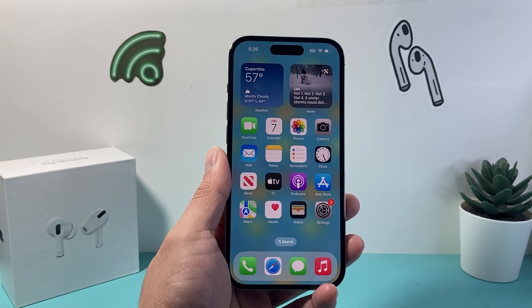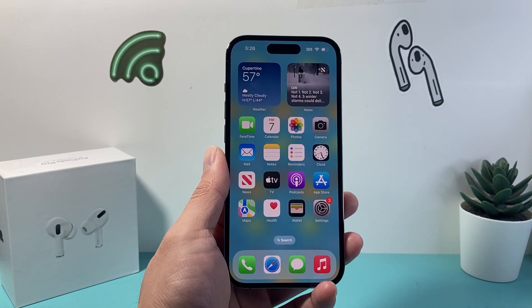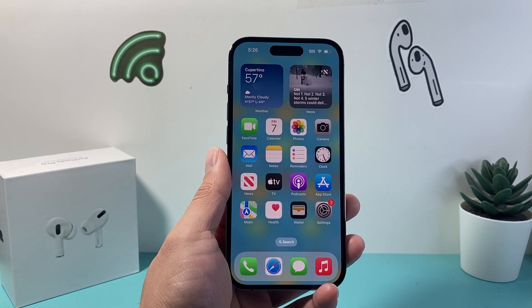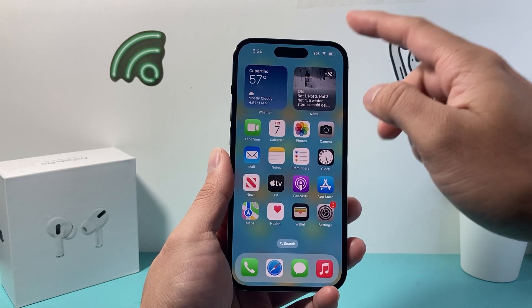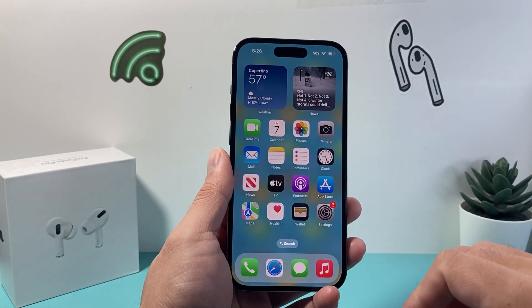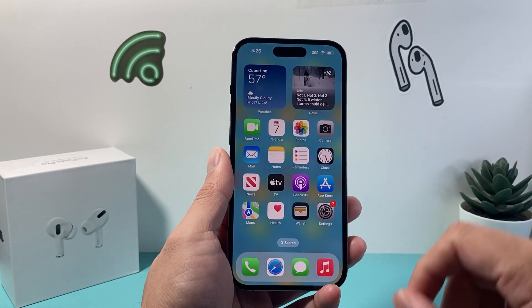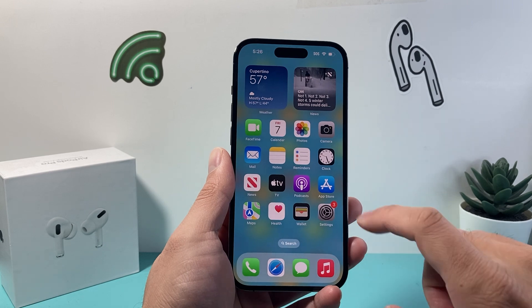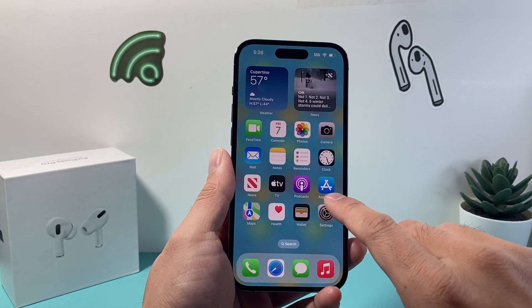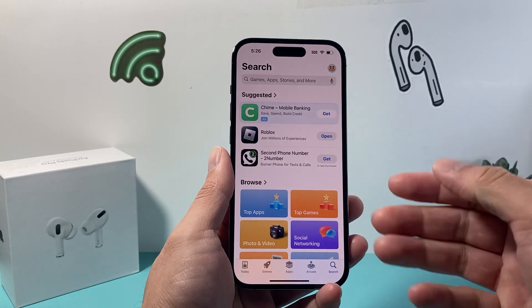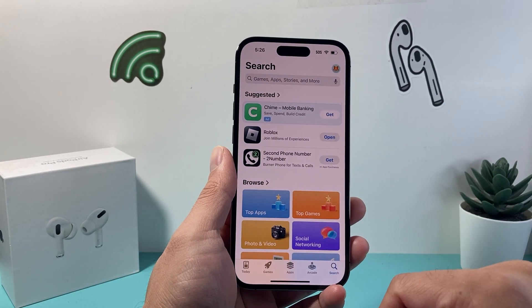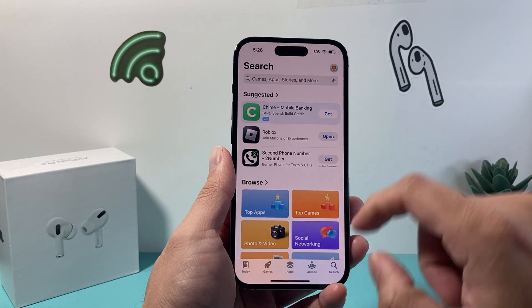In order to download any app on your iPhone, you do need to be connected to the internet, either through Wi-Fi or cellular data. Once you're connected, simply find the App Store app on your iPhone, which is the default app to download apps.